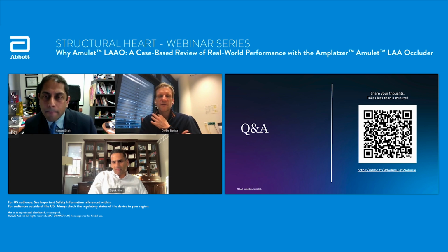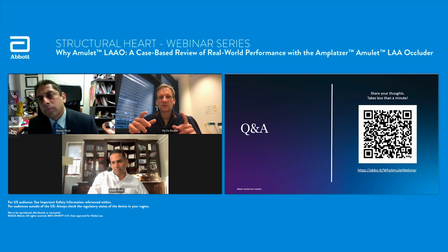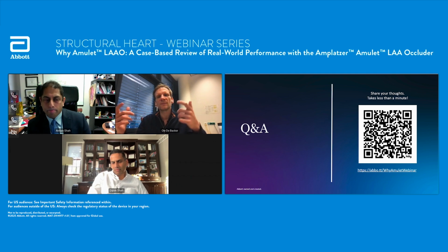Well, look, because I have cardiac CT up front for my cases, and I have them typically even a couple of weeks before, I can see which cases are challenging or not. And if I see a challenging appendage anatomy, you can easily submit these cases to FEOPS, and they come with these simulations. What they typically do is they simulate two different Amulet devices, two different sizes and two different implant positions, either more proximal, more distal, or you can even ask for a sandwich position also, so you can interact with the company and ask for other simulations.